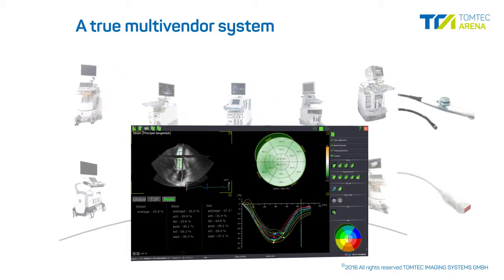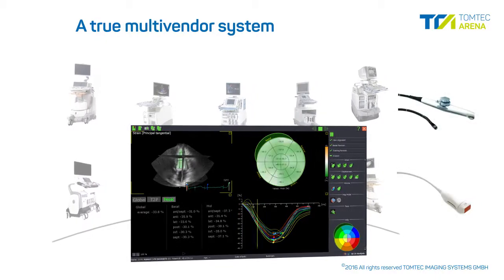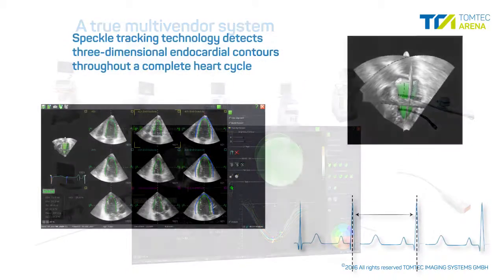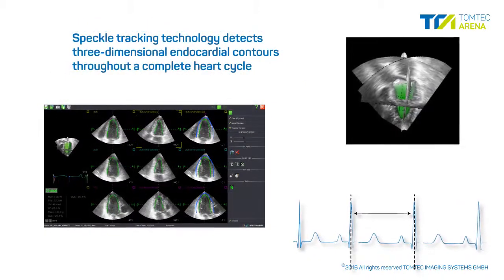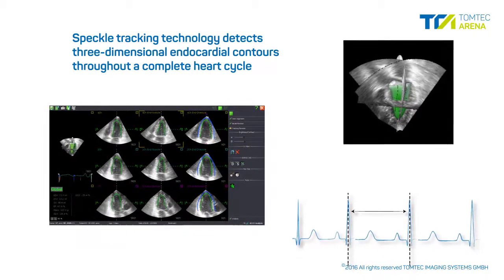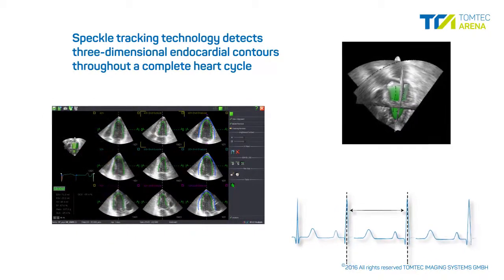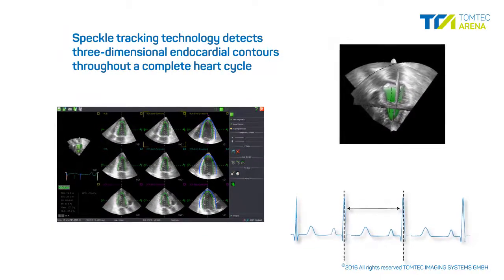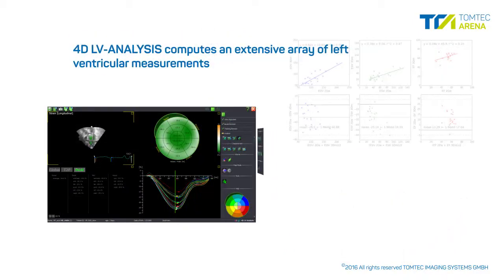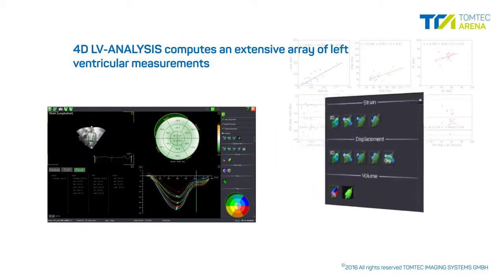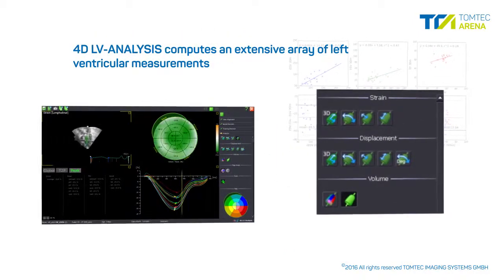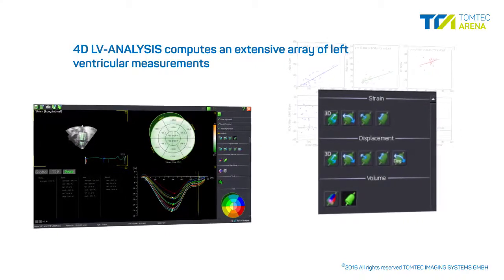Trans-thoracic and trans-esophageal volume data can be analyzed. Robust and proven speckle tracking technology detects 3-dimensional endocardial contours automatically throughout a complete heart cycle. Based on these contours, 4D LV Analysis computes an extensive array of left ventricular measurements.